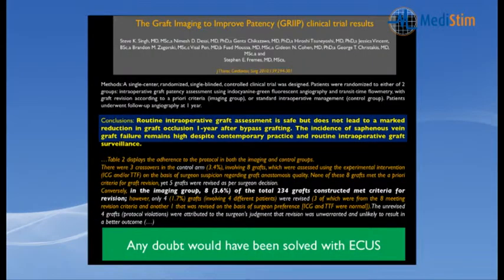This is a single-center, randomized, single-blinded controlled clinical trial, with patients randomized to two groups: intraoperative graft patency assessment using either indocyanine green fluorescent angiography or transit time flow measurement, compared to a control group with no assessment at all.